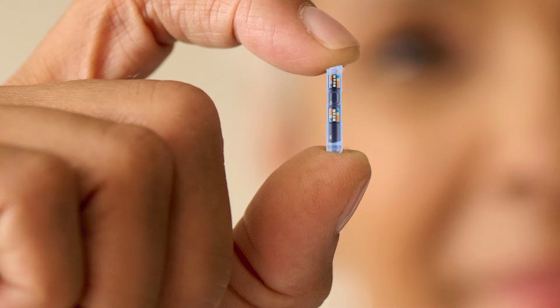And so this is testing the interstitial fluid, right? Because when you look at other CGMs, they have this little sensor that's this little tiny hair strand rod. This looks a bit different. Can you kind of tell us about the technology going behind that?